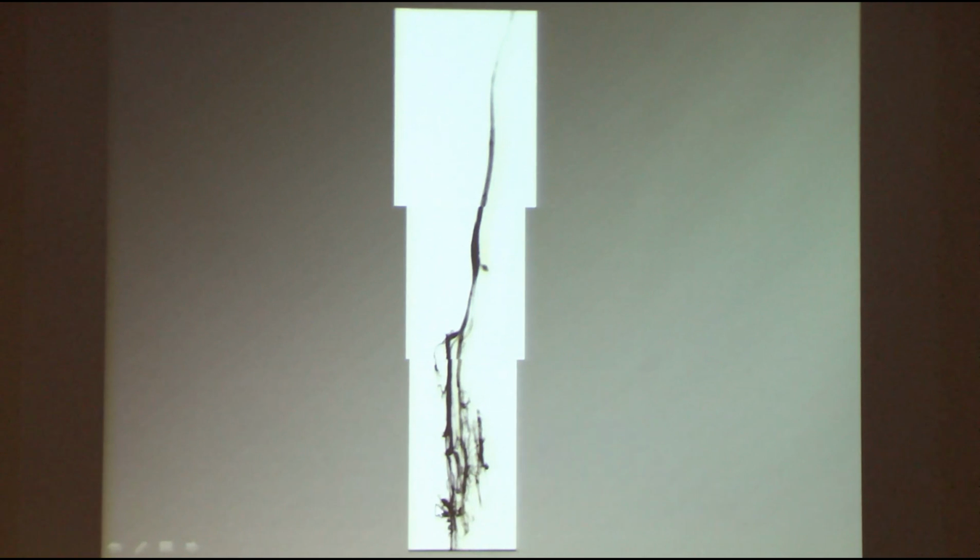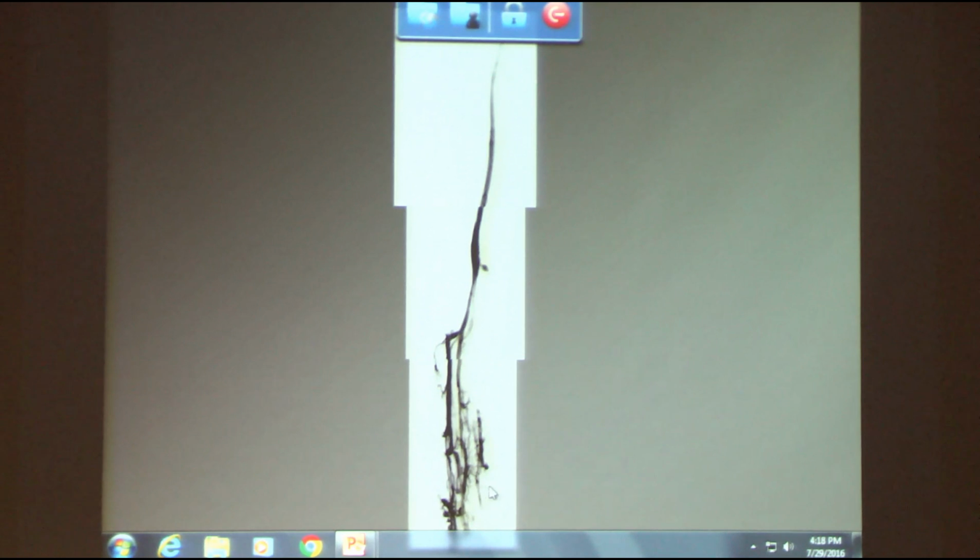And this is after closing the marginal vein. Now you see the deep veins better. You see that it's just not quite normal, but the flow at least is in the right direction.